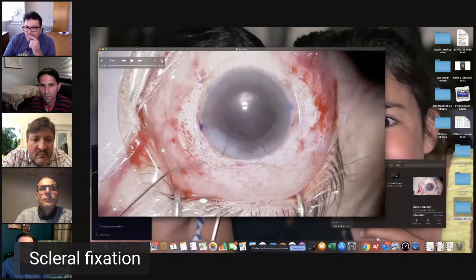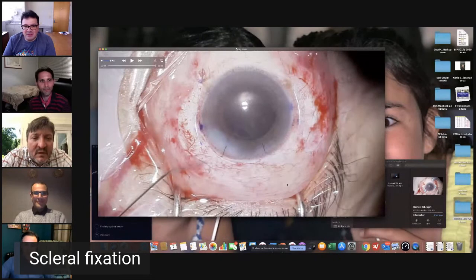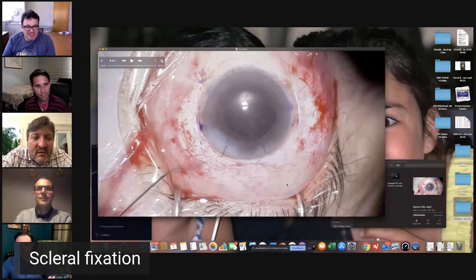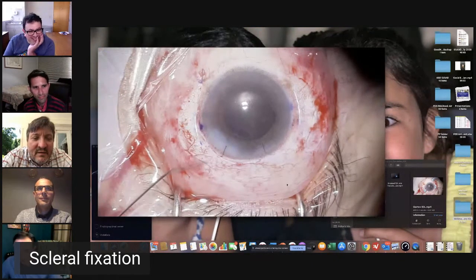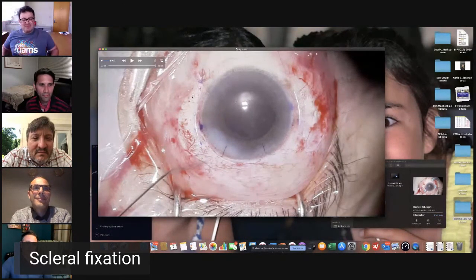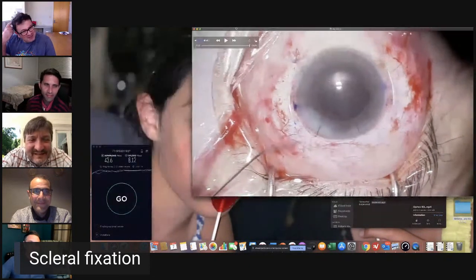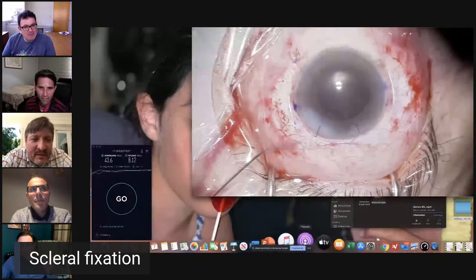So that was a much more sexy way of doing it, as Chris said, than what I did on my second case. And I'm not going to tell you about my first case because I used a bigger Gore-Tex suture than I should have. One of my colleagues thought that I was using a fishing rod there. So these are the cases of Gore-Tex.